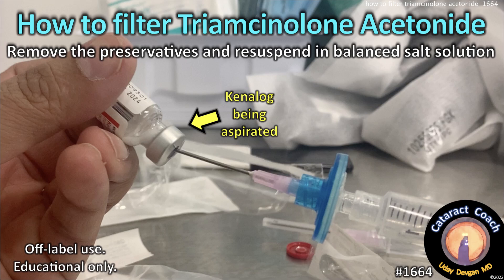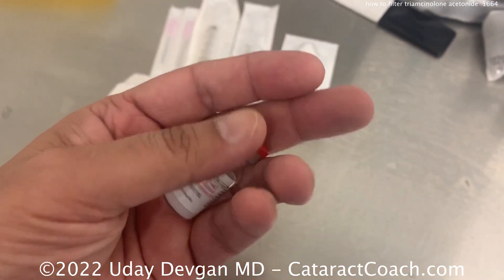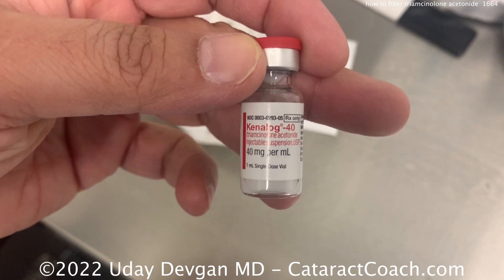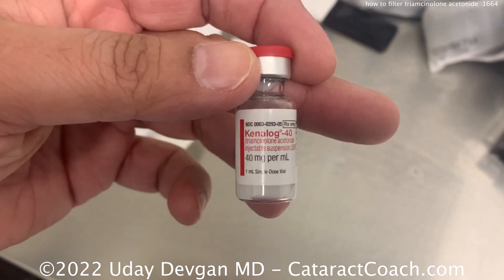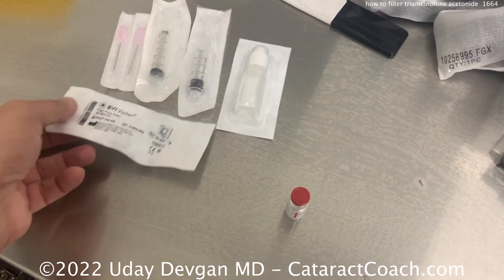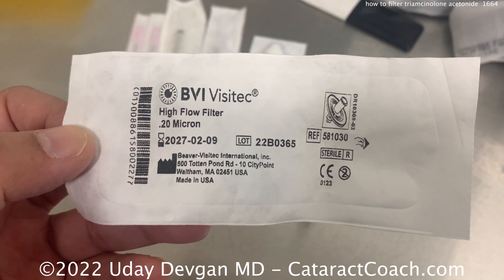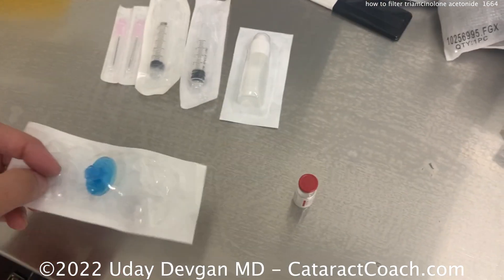CataractCoach.com — how to filter Triamcinolone Acetonide to remove the preservatives and resuspend it in balanced salt solution. Here is a brand name bottle of Kenalog, which is 40 mg per ml of Triamcinolone in a suspension. This has some preservative in it. Here is a filter from BVI, model reference 581030 — a very nice submicron filter.